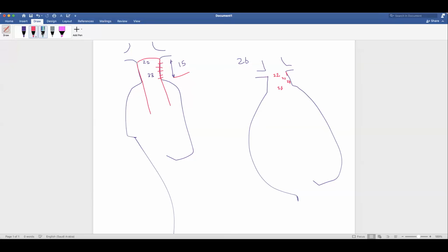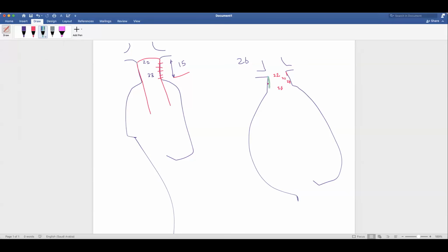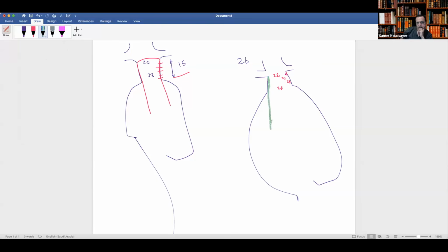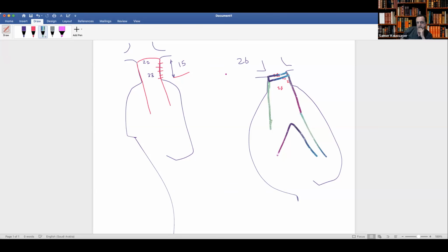So when I go and put a graft here, up to the 4 millimeters here, we have 20% oversize. So this is what's called a neck, because we have 20% oversize.